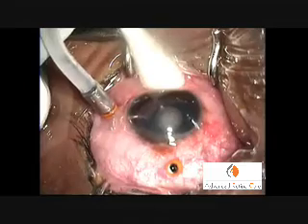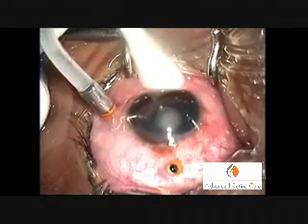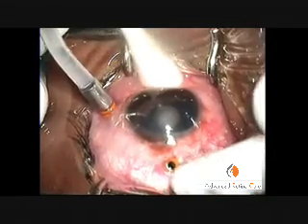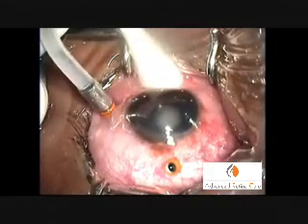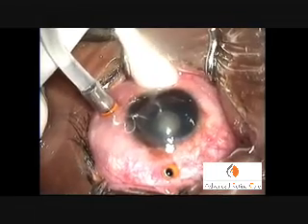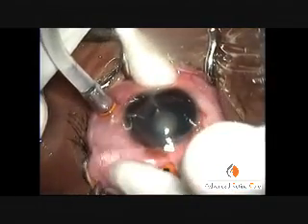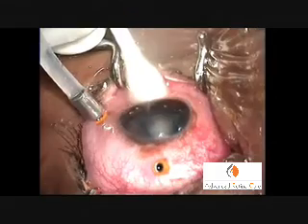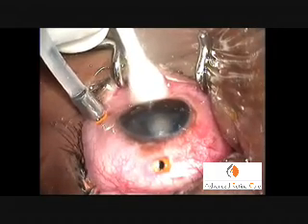Fluid in the infusion cannula under pressure, when injected into the vitreous cavity, displaces the silicon oil, which is seen to come at a constant rate from the open port. When 23-gauge instruments are used, the trocar ensures that the port is constantly open.